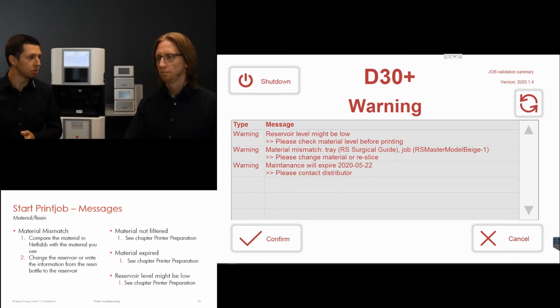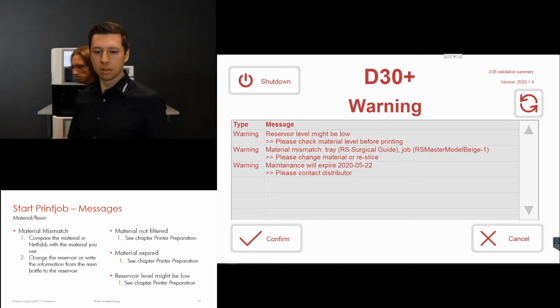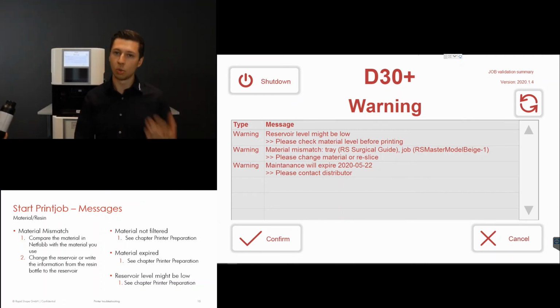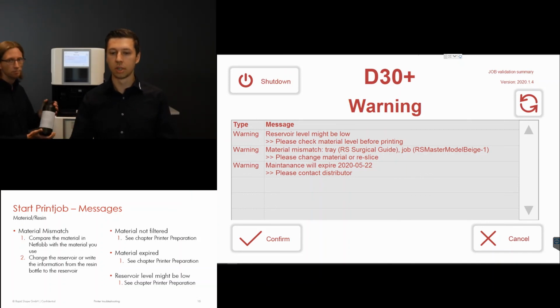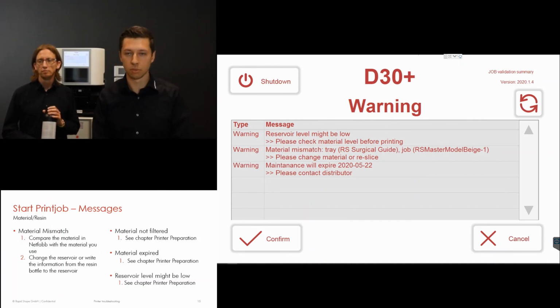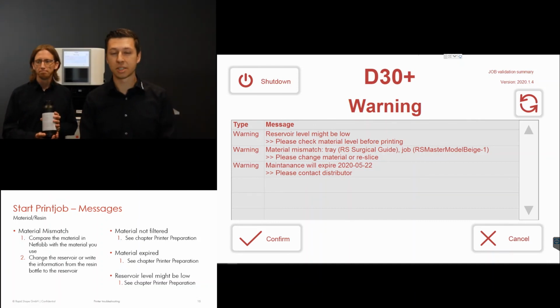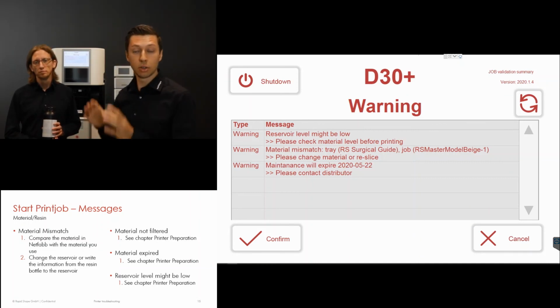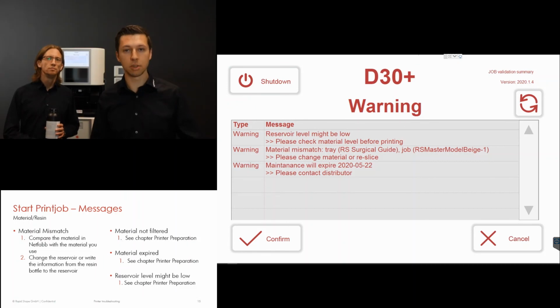Maybe Robert, you want to do it? Oh, definitely. Live? So we still got the material mismatch. Our job has the information about the platform as well as what kind of material we're using. The message tells us that the job has the material master model beige, and we got the bottle here. But the reservoir still has the information that it's filled with surgical guide. So now you should really compare where things have gone wrong. Did you select the right material in NetFab? If yes, that's good. Then you take care of the reservoir, and you change the reservoir with the right material.